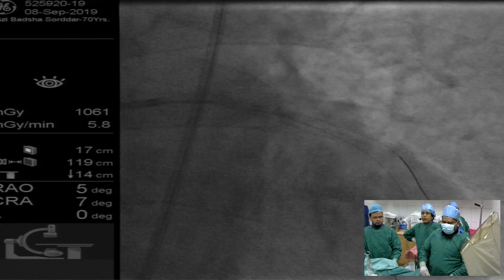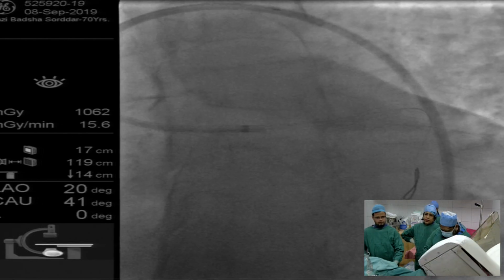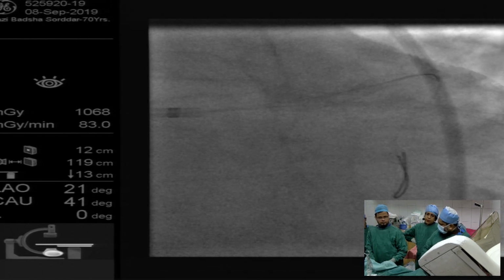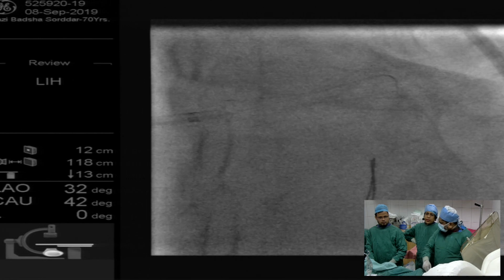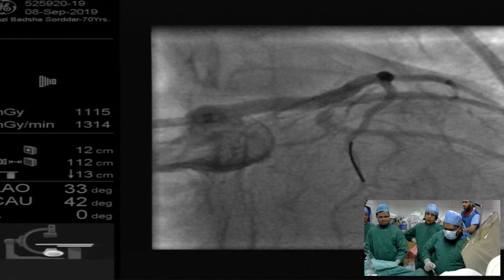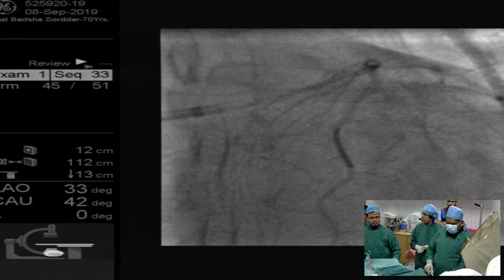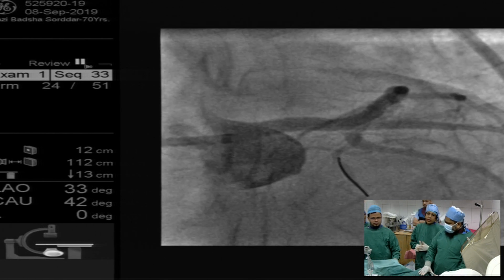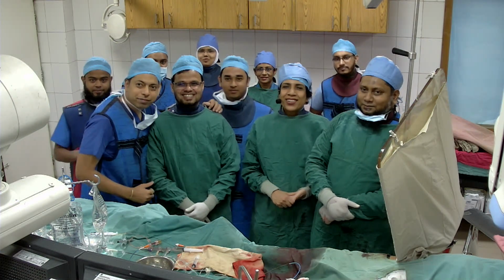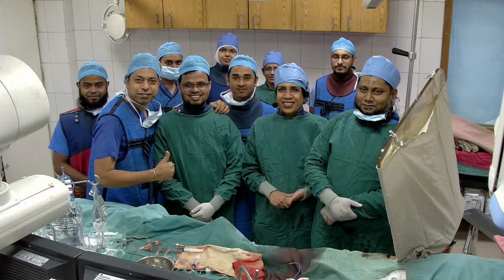And we'll just give her the first shot and this last shot, for our viewers to remember how we started. And we didn't lose our LCX. Okay. So that's us done. No more post dilatation. So we are good. Thank you. Yes, all of us. Yeah. Okay. So we just made history.